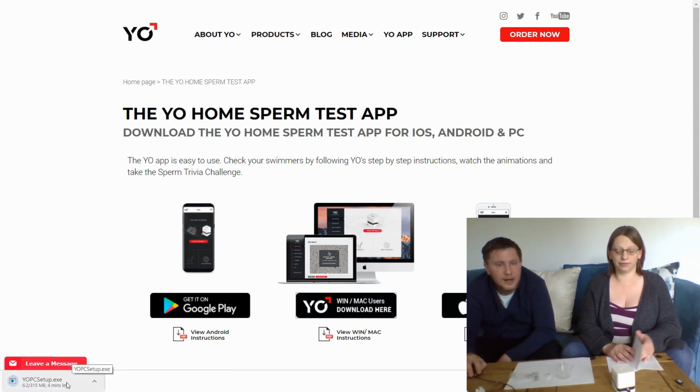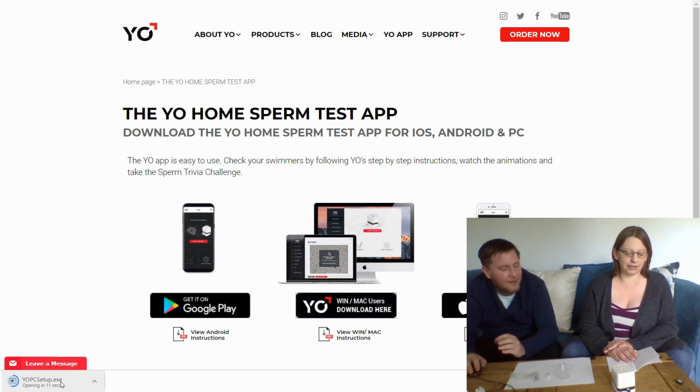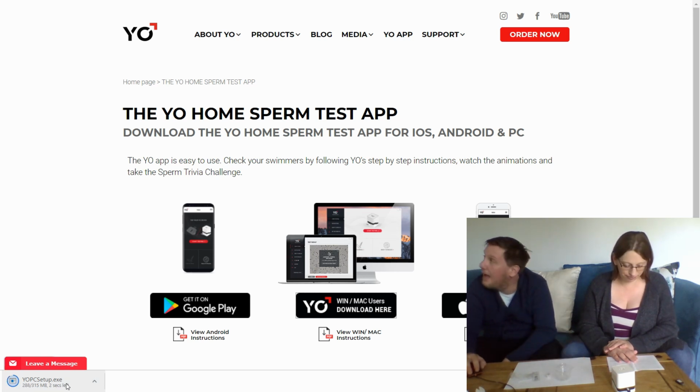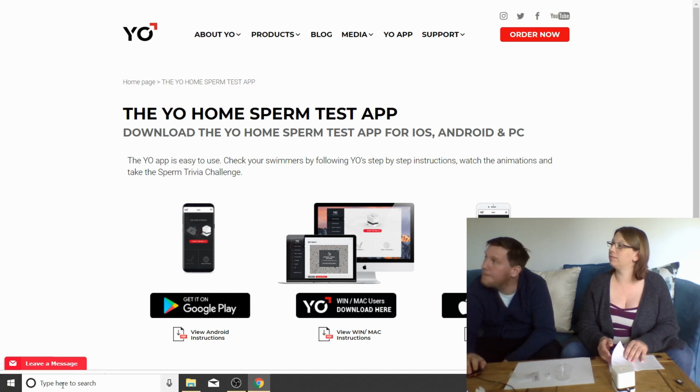While we're waiting for that, one of the things that's important to note whenever you're doing any form of semen and sperm analysis is that you abstain for at least 2 days. 2 to 3 is perfect, really. But it shouldn't be more than 6 days, because otherwise you start having issues with dead sperm. So I collected my little sample, which is mighty exciting, and we're going to do all of this with you on camera once this is downloaded, which it appears to be now.